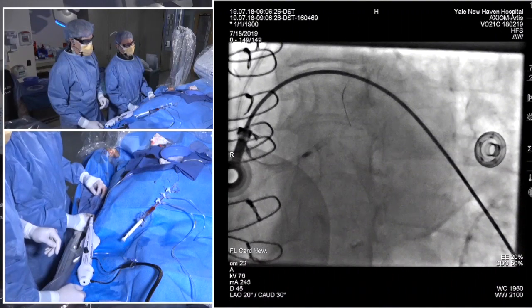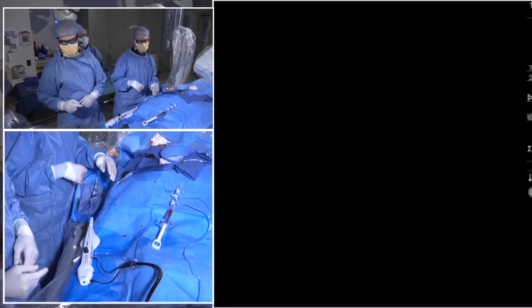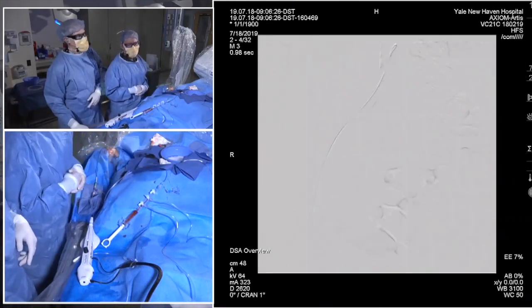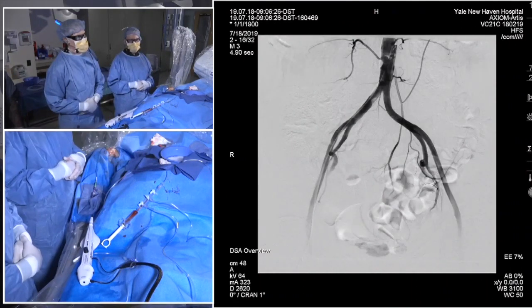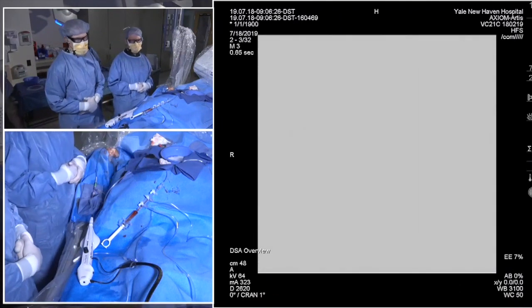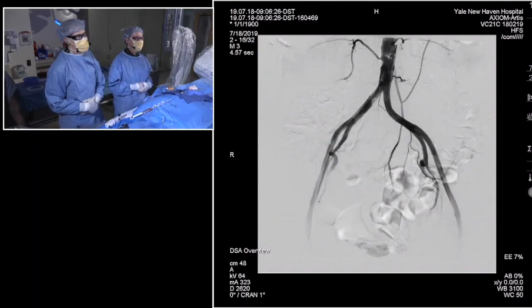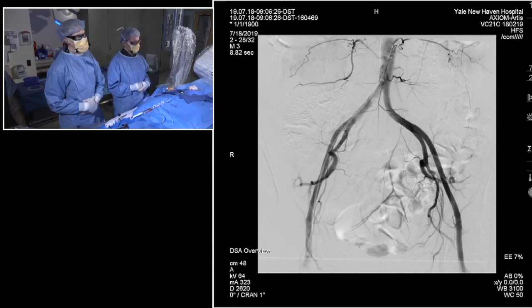But if they have significant peripheral arterial disease or aortic stenosis, those are things you want to be prepared for early, so you can get through or get an Impella in quickly if the patient decompensates. I couldn't agree more. Oftentimes we would do upfront ultrasounds, and this is a perfect example. It's being prepared so you know how to mitigate if things happen. Because the EF is fine, you have more time because the patient has more reserve. But if you don't have iliacs, you have no reserve, and there's no bailout.